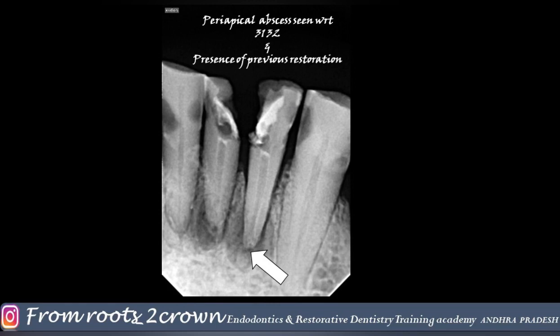After 1 week the patient complained of no pain and no swelling, so we regained access into the chamber by removing the temporary restorative material, and removed the entire water soluble calcium hydroxide intracanal medicament with the help of normal saline, followed by the irrigation protocol using 5.25% sodium hypochlorite and 17% EDTA liquid, followed by completely drying the canals with paper points.